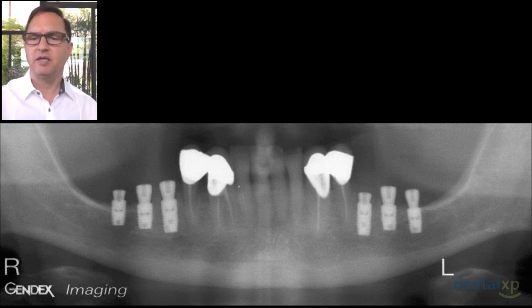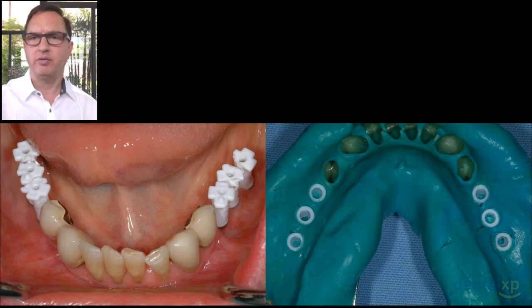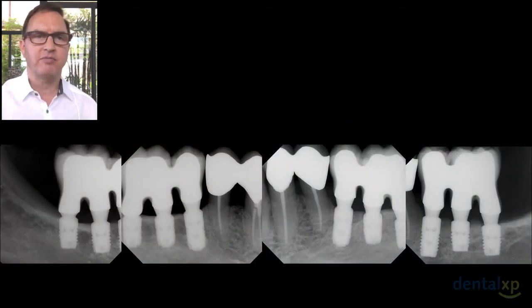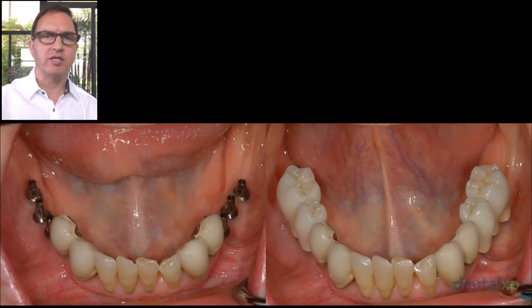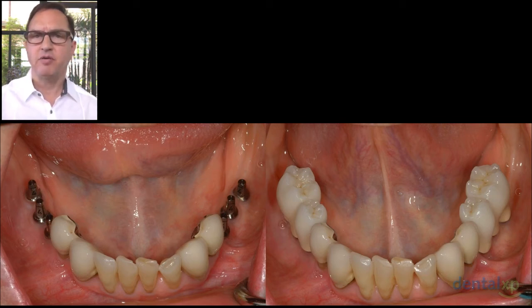Multiple implants were placed, impressions were created. Eventually, we used splinted restorations with the Dentsply implants 4.0 by 6 millimeter implants. These are very short implants, so there's an adverse crown-to-root ratio. We utilize splinting to augment the load carrying capacity and the resistance to displacement and rotation that might have otherwise been present should those have been non-splinted as opposed to splinted. So we have 2 implants per molar and 1 implant for the premolar and 3 implants for 2 teeth, splinting the units together as you see in these images.